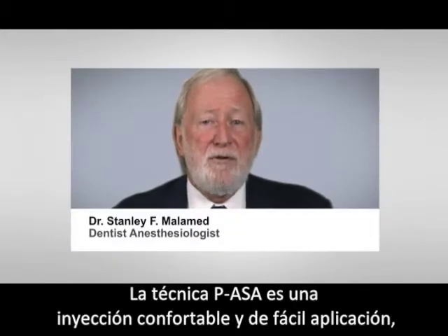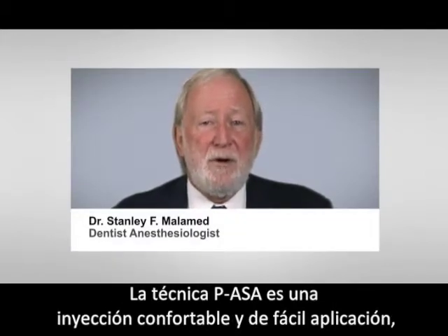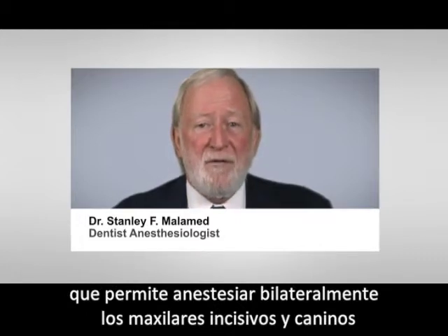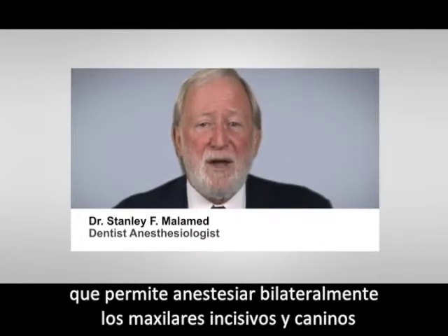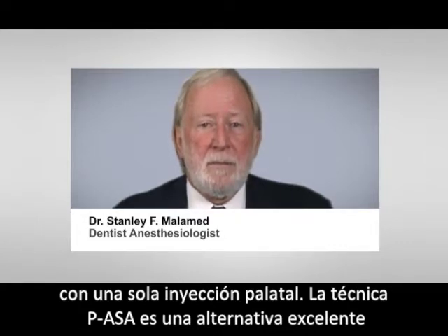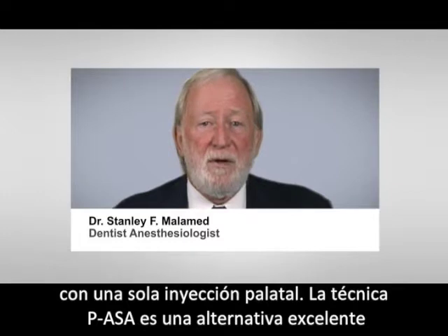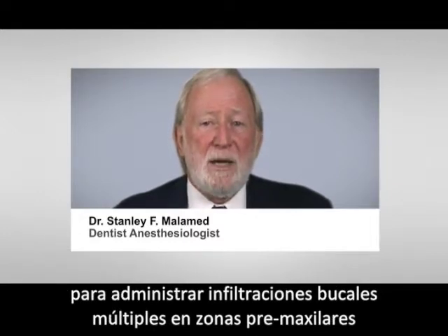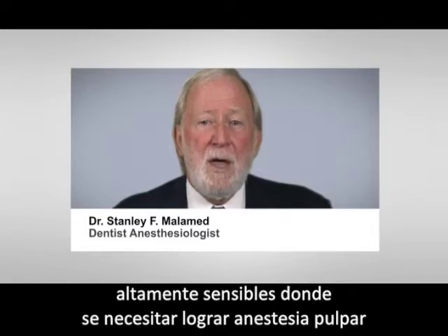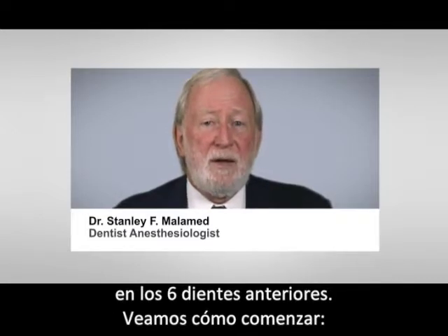The palatal anterior superior alveolar nerve block is an easily administered injection that allows the operator to achieve bilateral anesthesia of the maxillary incisors and canines from a single palatal injection. The PASA is an excellent alternative to administering multiple buccal infiltrations in a highly sensitive premaxillary region of the mouth when you need to achieve pulpal anesthesia to the six anterior teeth.